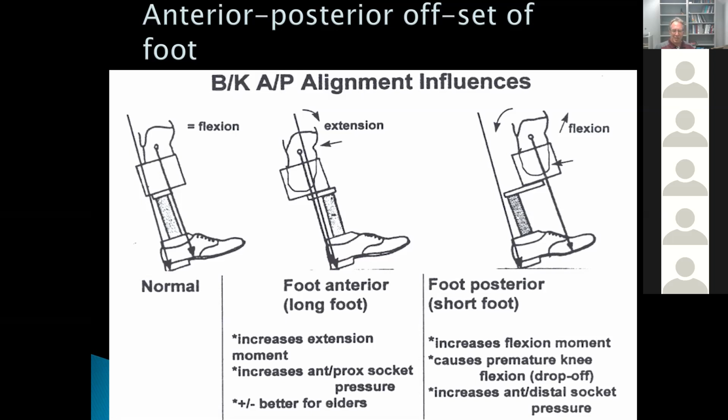But if you were a prosthetist, just so I can get you to think about this, and you had a patient who had just gotten their prosthesis for transtibial amputation, and you saw that during stance phase and terminal stance they were hyperextending. What could you do to the prosthetic foot or the pylon to help that problem of hyperextension?